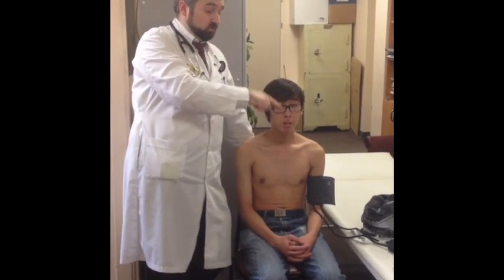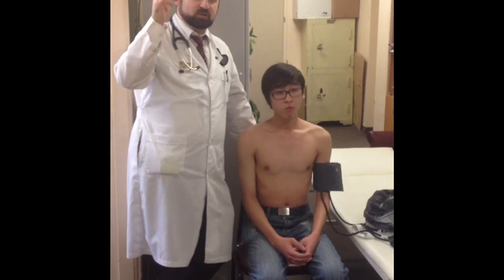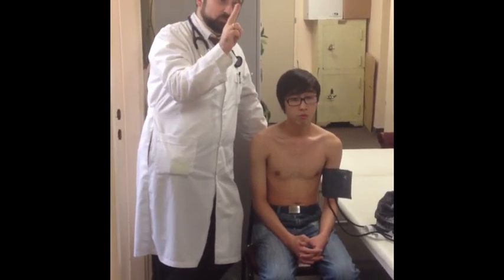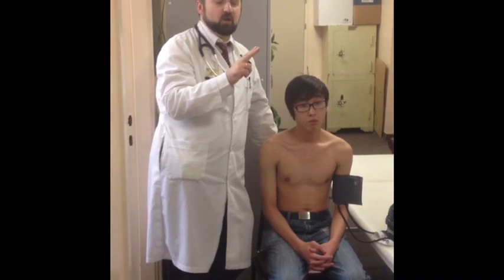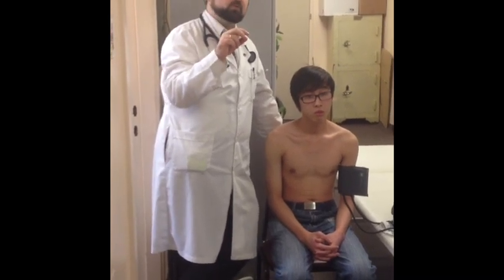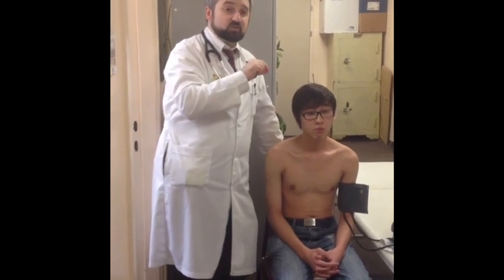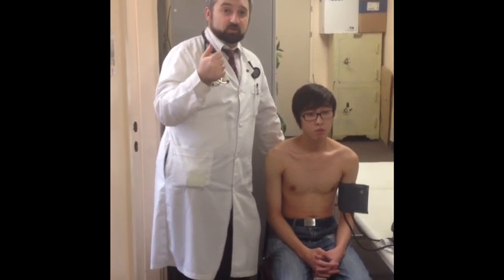The point on the scale where the first Korotkoff sound is heard is the systolic blood pressure. You then increase the speed of decompression until you approach the diastolic area identified in the first run, then decrease again at two millimeters per second. The point where Korotkoff sounds disappear or become very silent is the diastolic pressure. Then decompress the cuff fully. In practical life this two-run process is not always done, but these are the international recommendations.